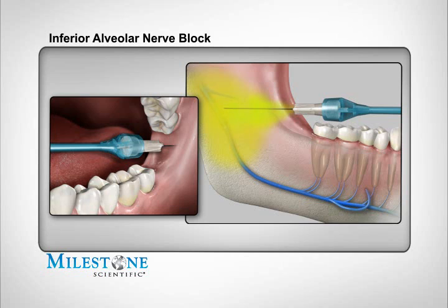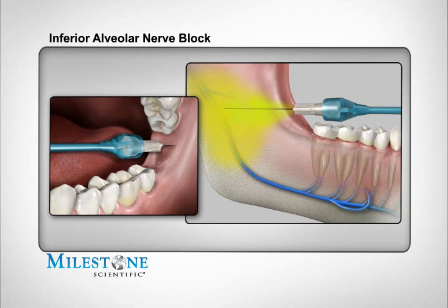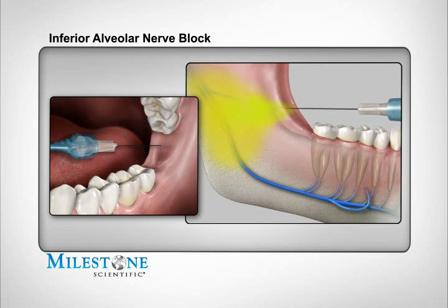When you've delivered the required dosage, you can remove the needle. To avoid anesthetic solution spray back into your patient's mouth, perform the following. While the needle is still embedded in the patient's tissues, depress and release the foot control pedal. Count 3 beeps after releasing the foot control, and then totally remove the needle from the patient's mouth. Direct the needle away from the patient, as a small amount of anesthetic solution may still be present. Should you require more than one anesthetic cartridge, you can reload subsequent cartridges and continue as required. Please see the section on multi-cartridge technique.